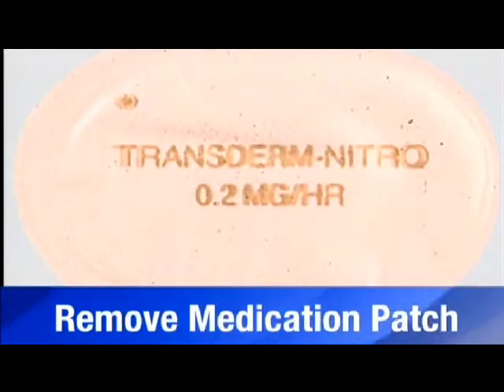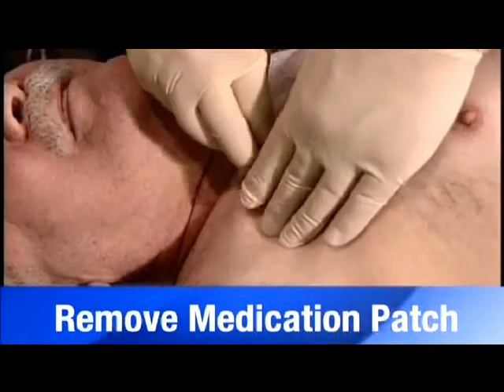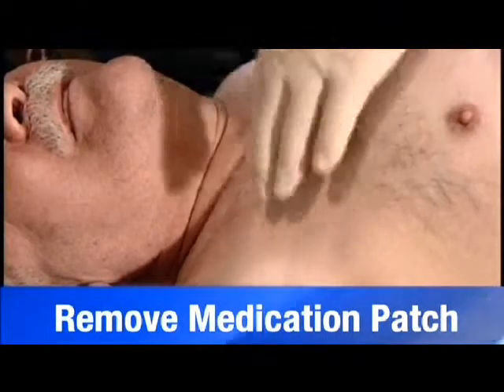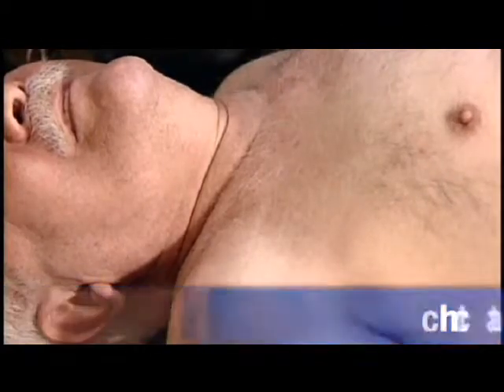Remove any medication patches and wipe the skin clean before attaching the AED electrode pads.